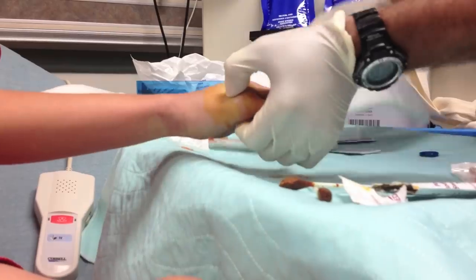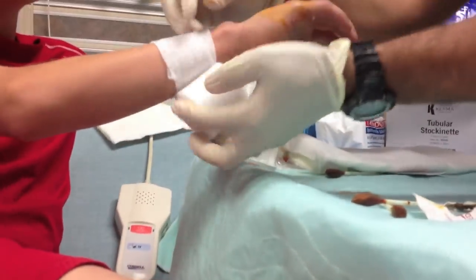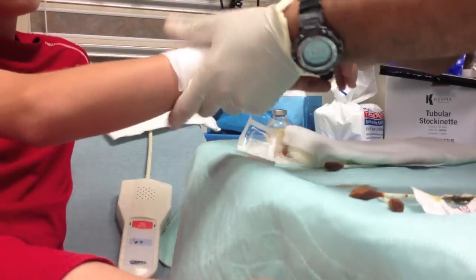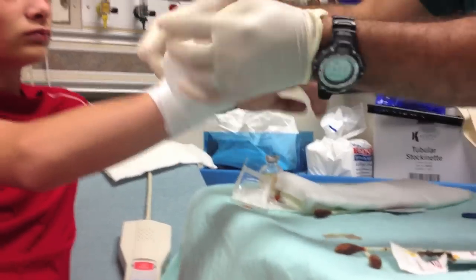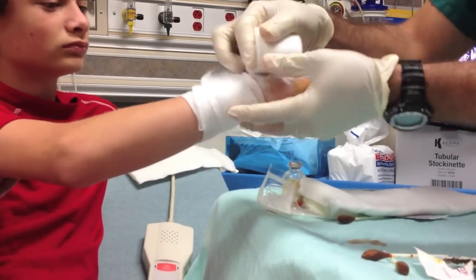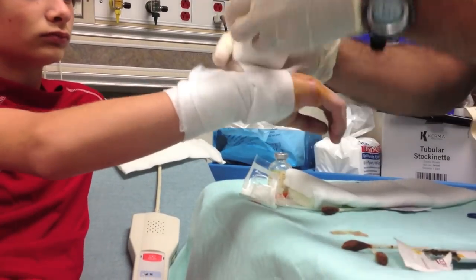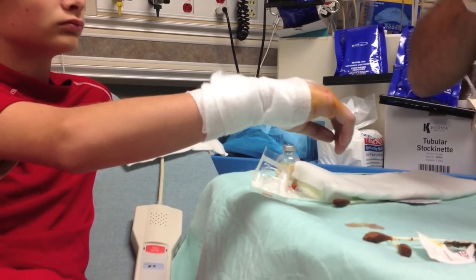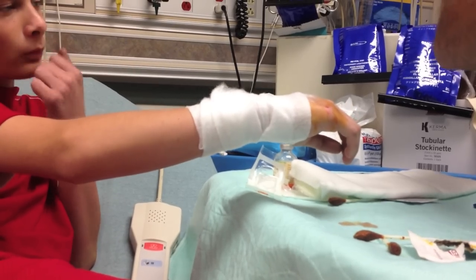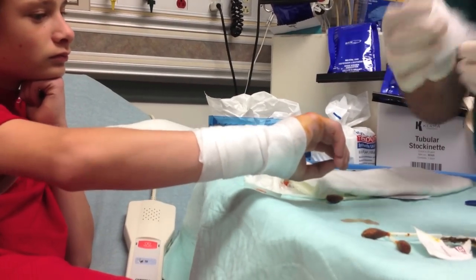And then we're going to splint right there. So before we splint, we're going to use this. That should set it back in place — hopefully. We'll do an x-ray to see where we're at. Once I go with the splinting material, I'll put a little more pressure on it. The problem is because it's so loose there's nothing really holding it in place — I let it go and it falls back down. So what I've got to do is reduce it and then hold it in position.